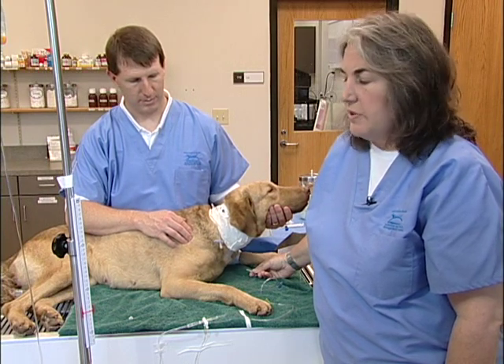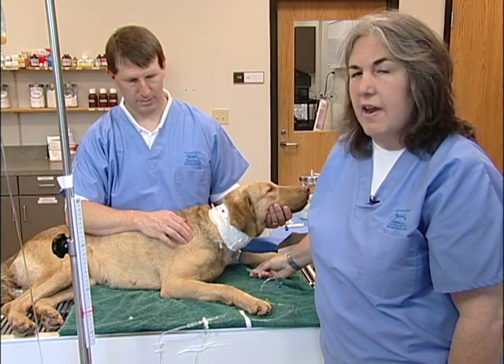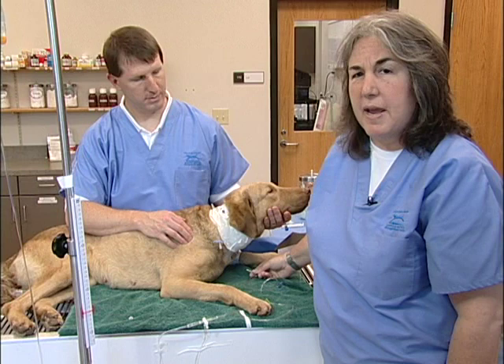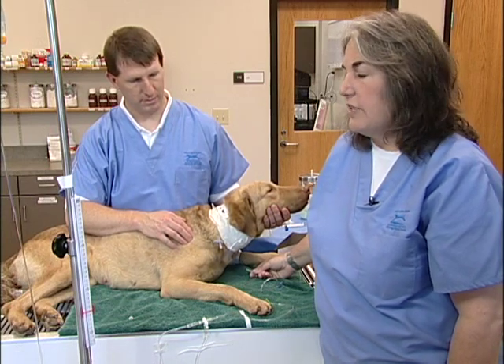We can see that the fluid level has stopped right around three centimeters of water — that's a really normal CVP reading for this dog. We like to see normal CVP at under five centimeters of water. But because of the variation in positioning and setting up the manometer, we really establish a baseline for each patient and then look for a change of five centimeters or more.